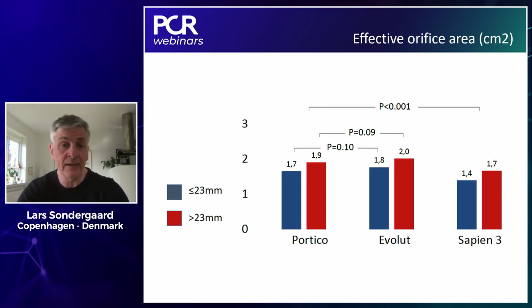So we can see the recorded case now. We're going to skip all the first part. So we start where we have a pigtail down in the left ventricle. So if you start the case now. So we can start here looking at the hemodynamics, Ole. Let's see, we have a couple of extrasystoles. I can come a little bit back with the pigtail, yeah, like that. See, you have a more stable rhythm.